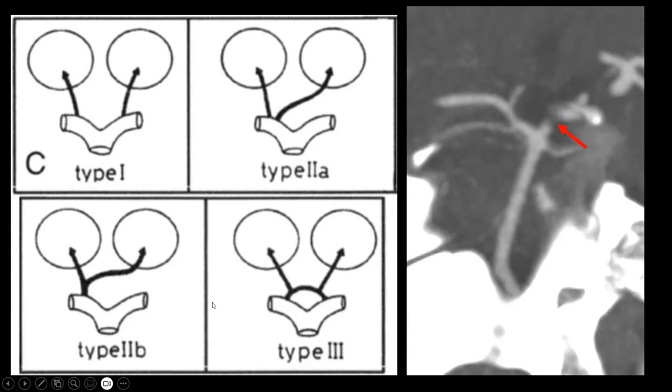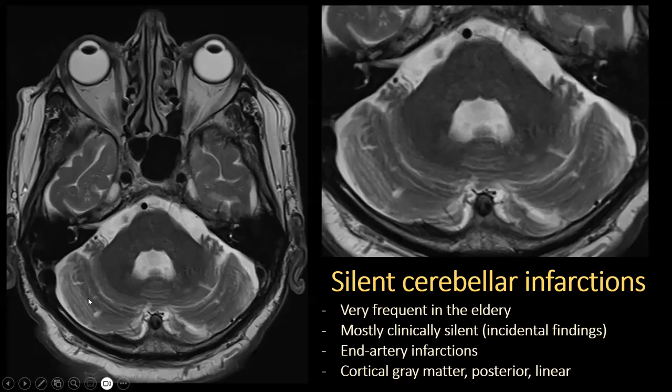I believe this variability, well, we cannot depict this on CT angiography, we cannot see it on MR angiography. It's just something to keep in mind that even when it comes to the artery of Percheron, there's a lot of variability over there, which can cause some variability in what you see on your MRI studies when it comes to the final stroke pattern. So this is what we assume occurred in this patient, either this situation or this situation, I'd say. One of these is possible.